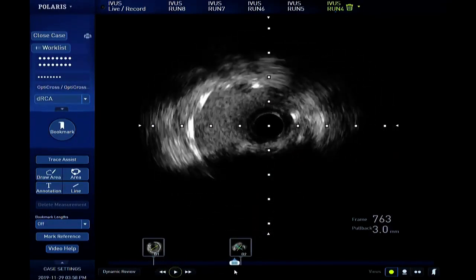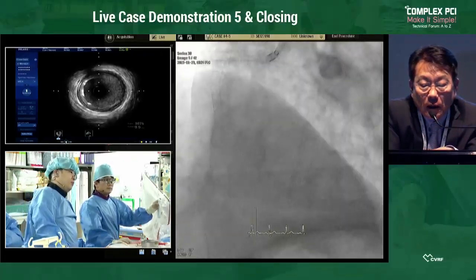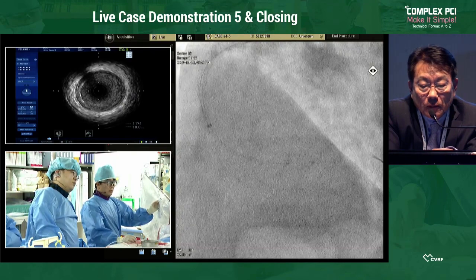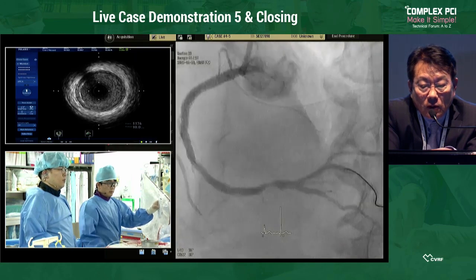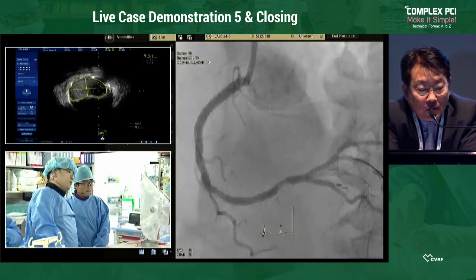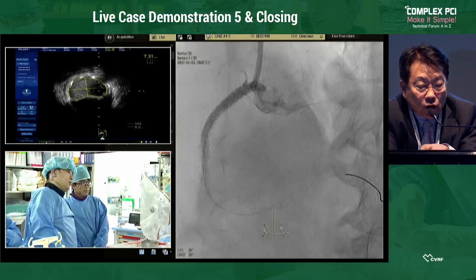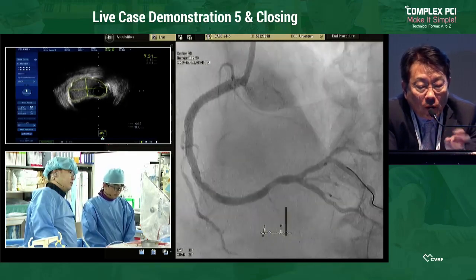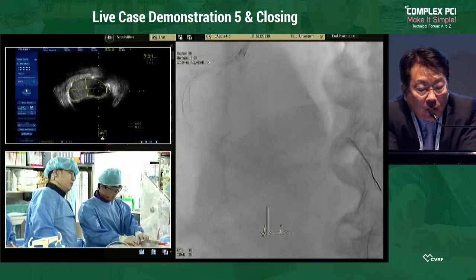Okay. I will show you the proximal stent IVUS. Dr. Lee, would you show us the angiogram before the distal stent procedure? I want to see the second lesion. All right, so right here we are. Yes, that one, right? I want to discuss function concerns. Dr. Lee, you are a plumber, I know that, right? You are a CTO guy. However, the distal part is a discrete narrowing, 60-70% stenosis, with a minimum lumen area of about 3 millimeters square, something like that. If you do FFR, what do you think?